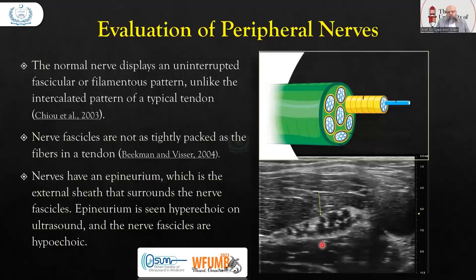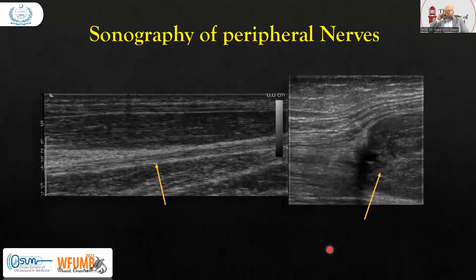If you look at a nerve, you will find hypoechoic areas which are the nerve fascicles, and white hyperechoic bands around them are the epineurium — the sheath around it. This is how the nerves appear. You can see the longitudinal view of a normal healthy nerve here.